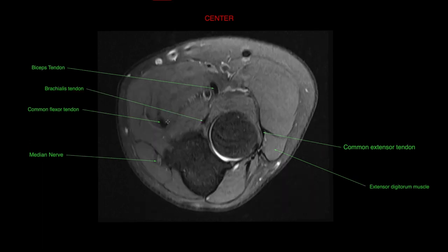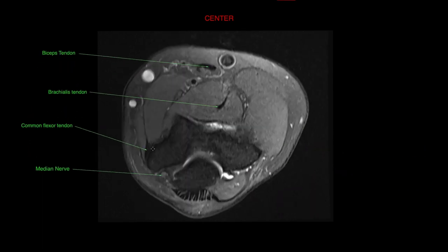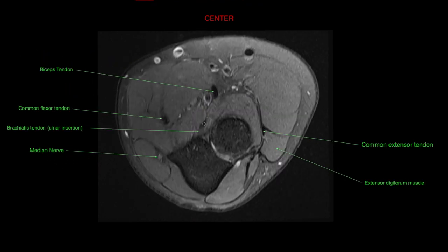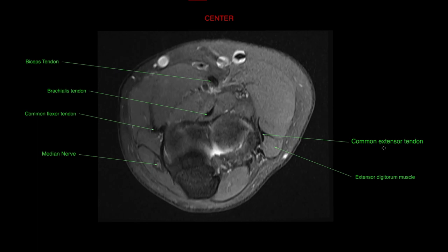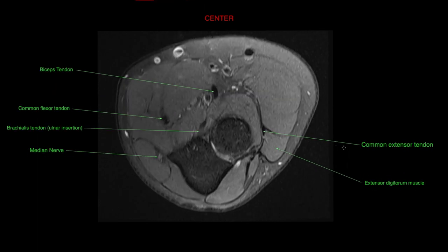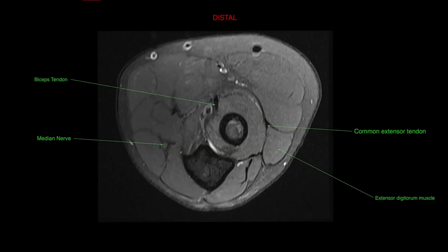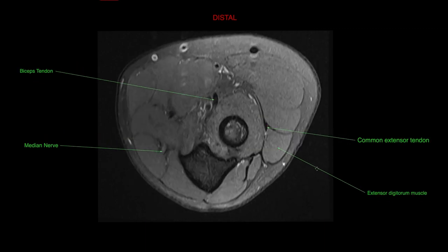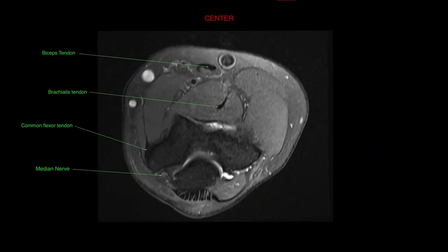The common flexor tendon can be seen here as well, coming in and attaching. The brachialis tendon is also coming through and attaching. On the other side, you have your common extensor tendon, which is attaching to the lateral side. Alongside, just inferior, is the extensor digitorum muscle connecting as well.